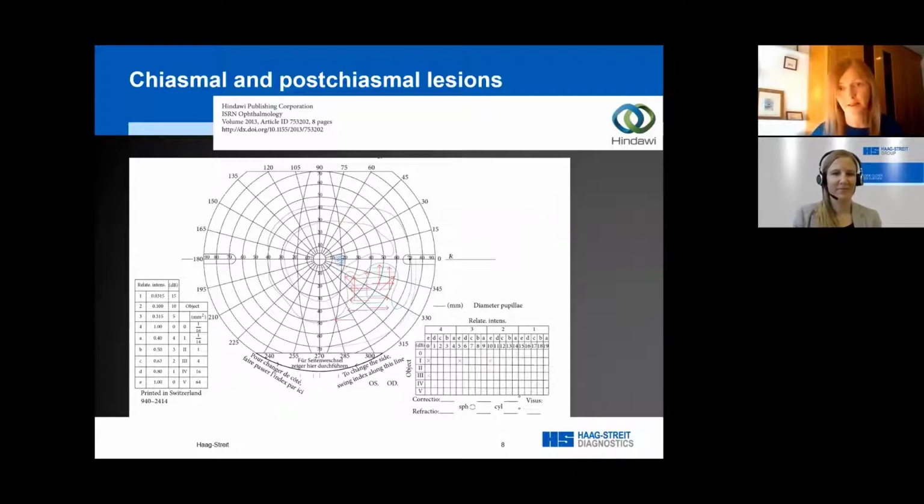We show this effect, particularly in relation to functional vision and peripheral field, as in this example on this slide. This is one of our stroke survivor fields of vision, where the bulk of the field loss is in the peripheral infratemporal visual field. And that defect was not fully represented by the central static test for that patient. And this is also applicable to other disease, such as for glaucoma patients who've got moderate to severe disease. So really, it's not uncommon for the central and peripheral visual fields to be mismatched. And that's why we need to be aware of what's going on in both central and peripheral visual fields.